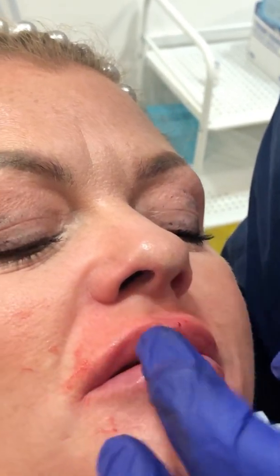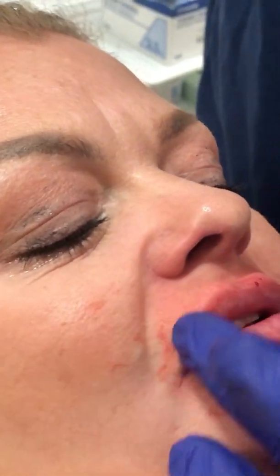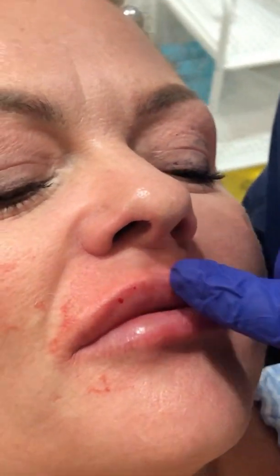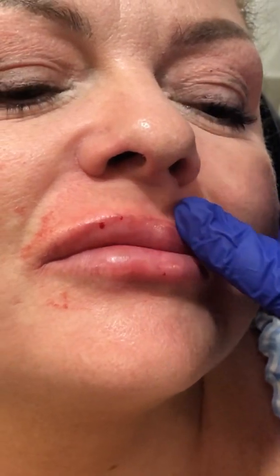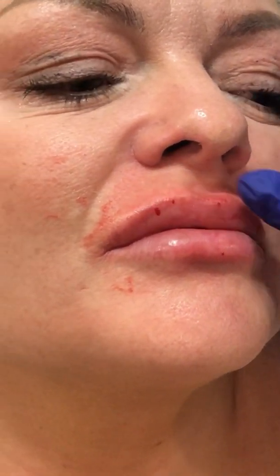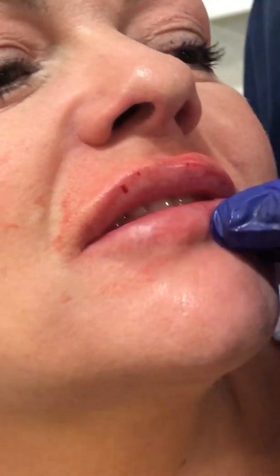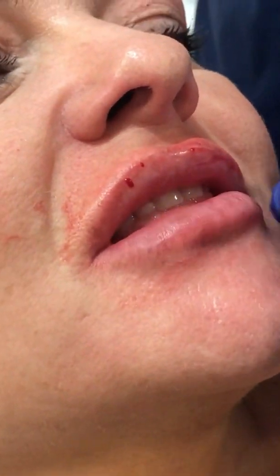We can see on this side the filler is almost literally gone on this side of the lip, which is lovely. It's been a bit stubborn here in the middle, so we might pop some more in. It's been a little bit stubborn on this side and the bottom lip is going very slowly, but it is going.